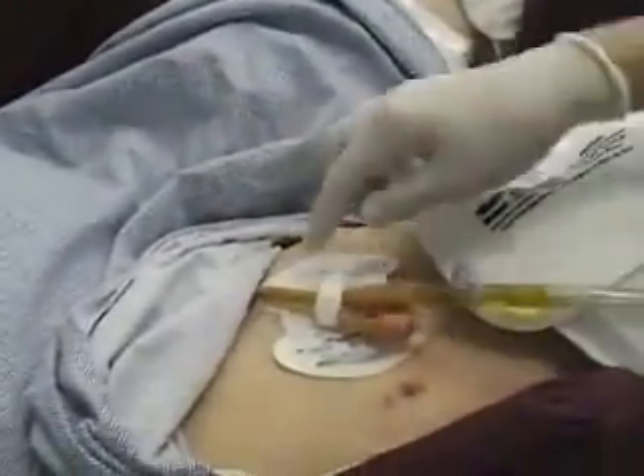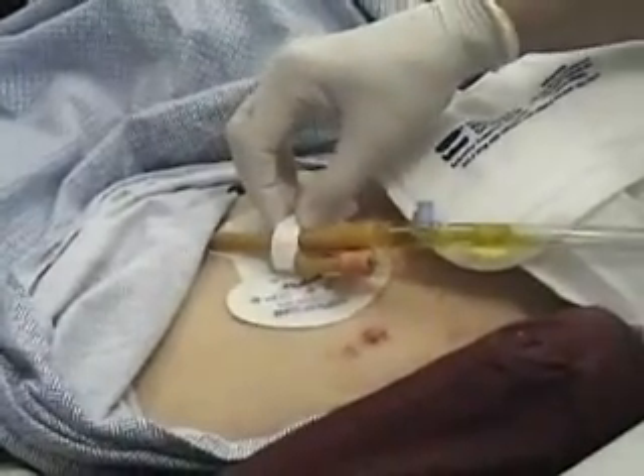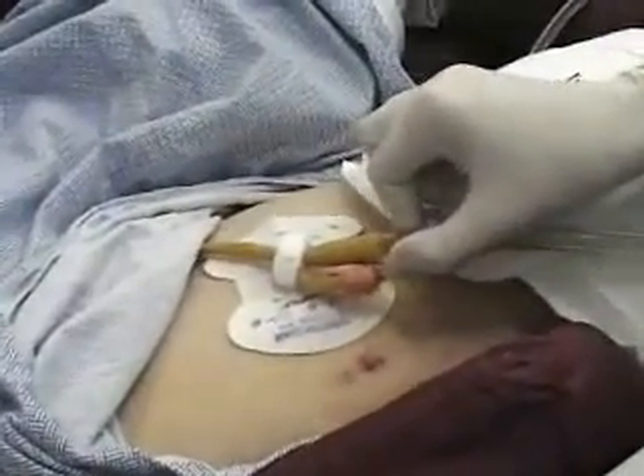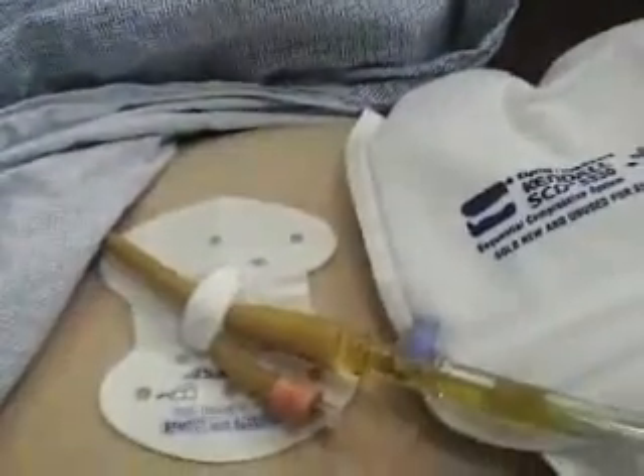Mrs. Jones has a Foley catheter and I'd like to show you how we attach it to the leg so that it doesn't pull on her. There are these little stick-on devices that will hold on to the Foley catheter, so if it gets tugged at all, it won't pull out from her body and cause her any pain or discomfort.